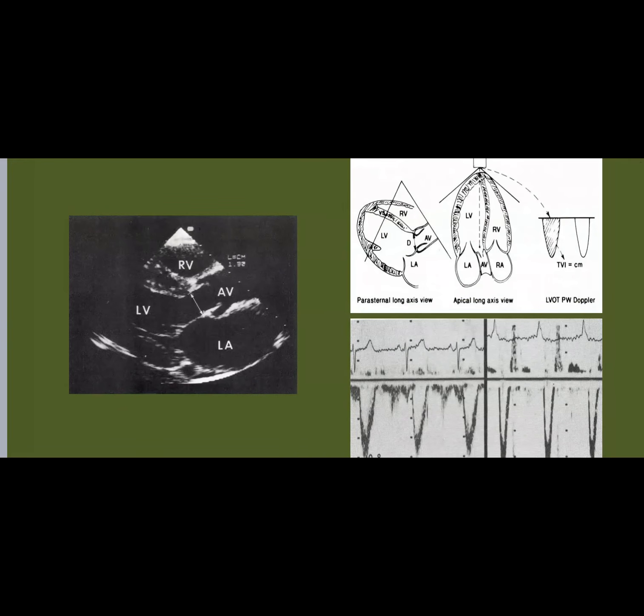We calculate the stroke volume. Now, what is the relationship between the ejection fraction and stroke volume? Can anybody tell me? The ejection fraction is a percentage of the volume ejected by the LV. So stroke volume divided by the end diastolic volume will give the ejection fraction. Exactly. Here is the relation between the volume ejected and the end diastolic volume.